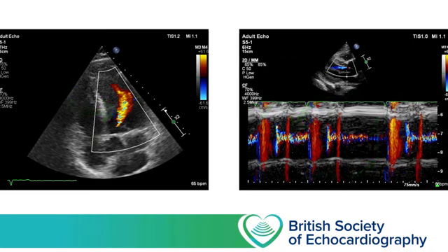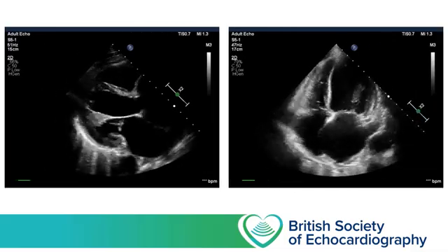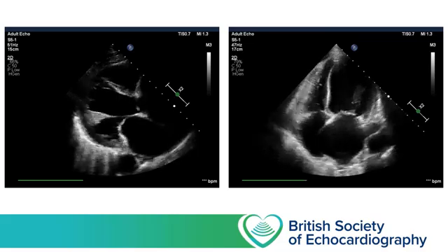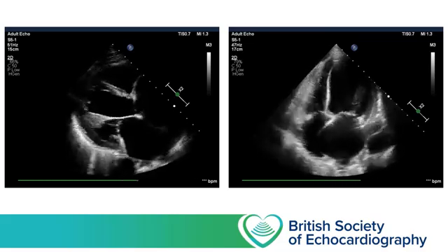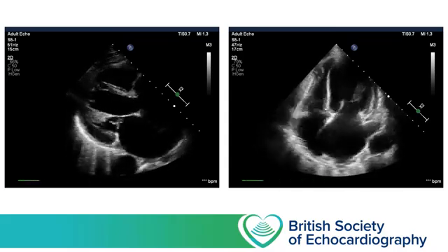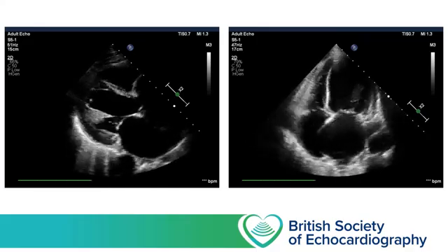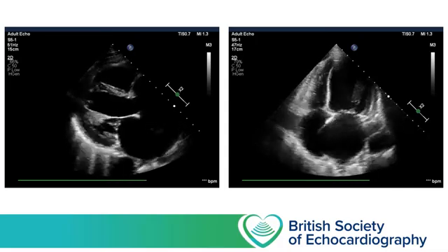outflow tract diameter. This next example is from a female patient who presented to the emergency department with severe chest pain on the background of several months of increasing breathlessness. Here we can see her parasternal long axis view and apical 4-chamber view, and in the 2D images we can immediately see some striking abnormalities. Chief among these is a severely dilated aortic root, measuring approximately 6.5 centimeters across the sinus.